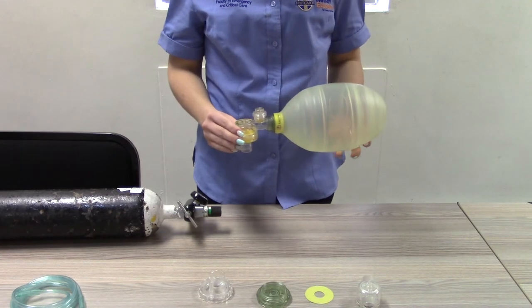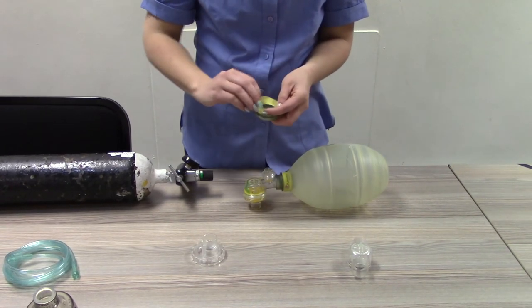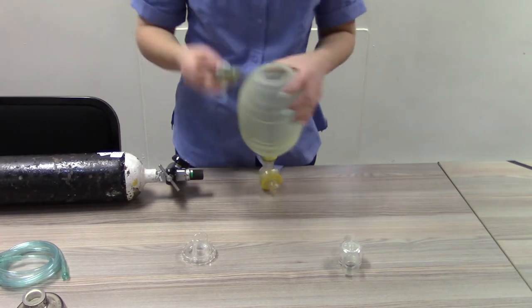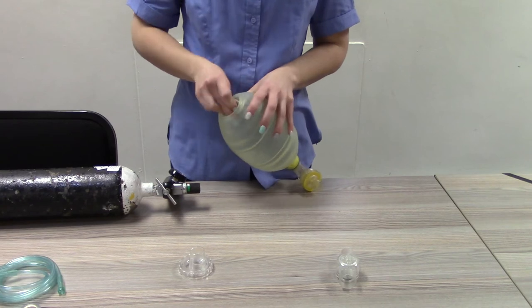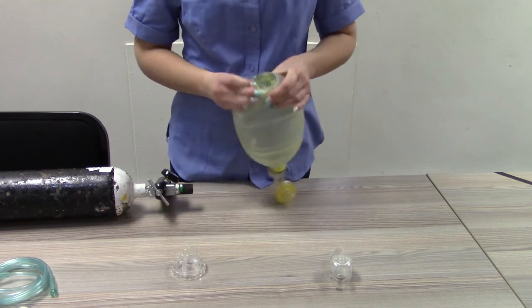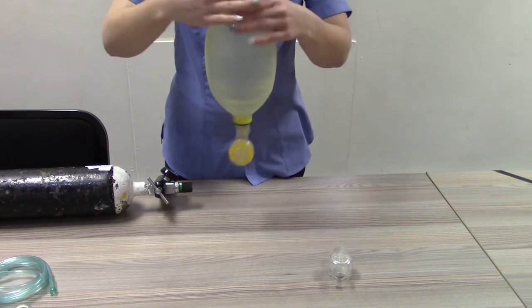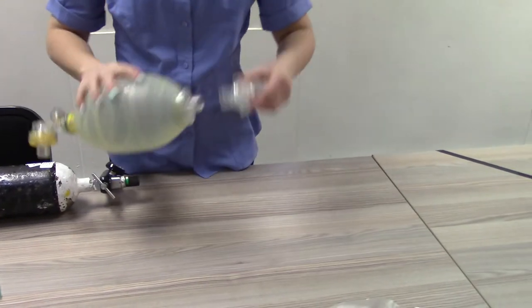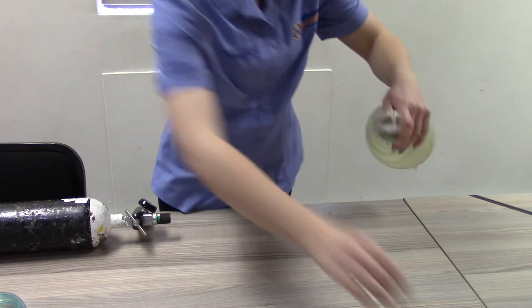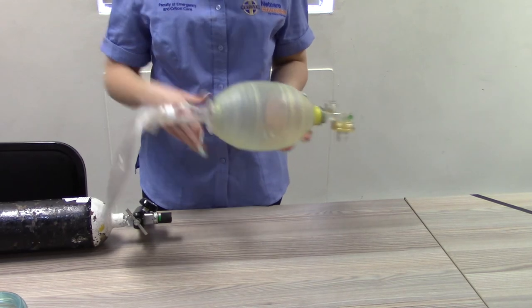Connect the intake valve to the ventilation bag. Attach the reservoir valve to the ventilation bag. Attach the correct oxygen reservoir bag to the reservoir valve. Then attach the correct size face mask to the patient connection port.